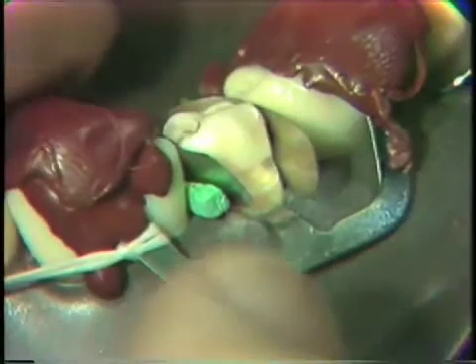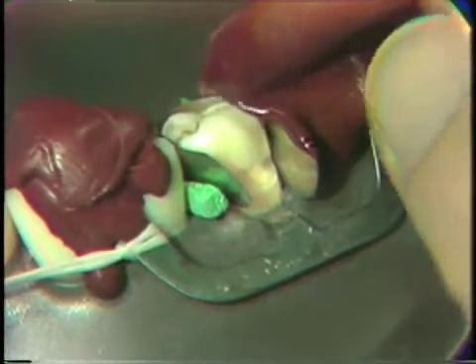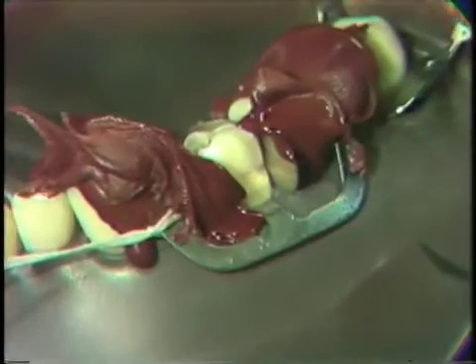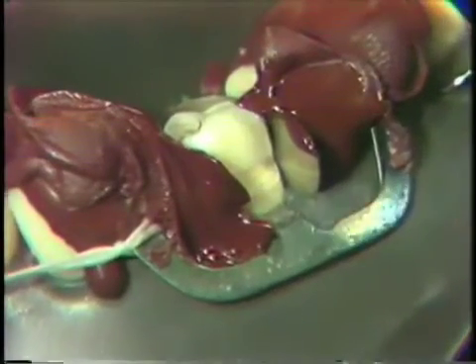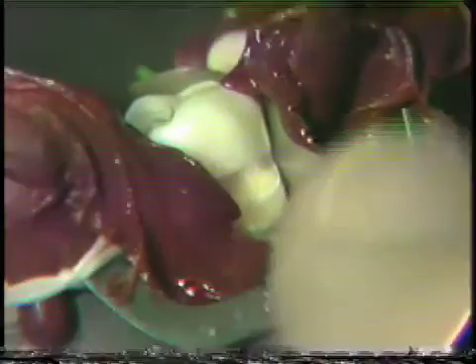Now with our matrix in place, we will apply compound to back up this matrix so that we can support it when we condense our amalgam. Using a high-fusing compound that's been heated, we will add compound to the sides of the matrix, attaching it to the adjacent tooth. To ensure that this matrix has been pressed up against the tooth, we heat an instrument, press the matrix against the tooth, and let the compound gently cool.